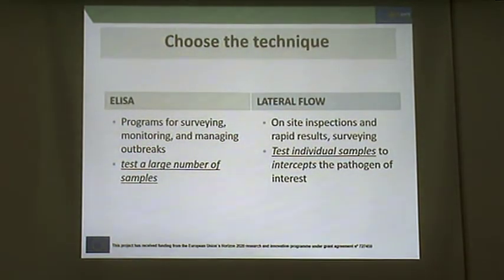Just to compare the intended use of the two techniques, as we said before, ELISA is for large test numbers, the lateral flow is to intercept the pathogen.